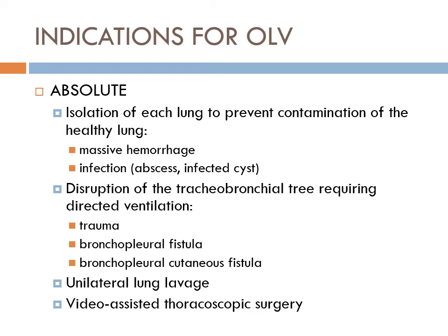Before you tape your tube, listen to breath sounds on both sides. The person who's listening should then go and listen over the cricothyroid membrane. And do this before you tape your tube, because if you were in the mainstem, you would have been able to correct this.